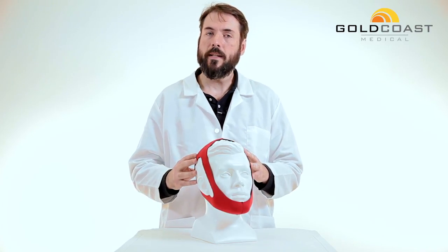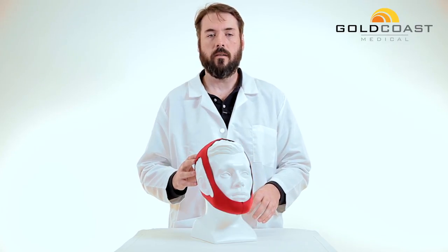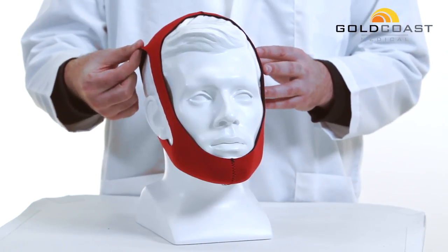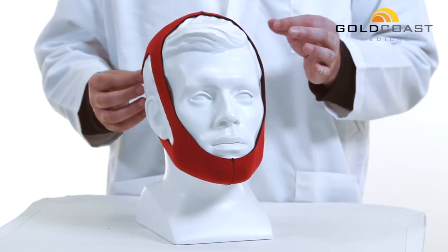This is a soft, breathable, latex-free material that will ensure a comfortable night's sleep. These straps are very stretchable, which creates a comfortable and less restricted feeling.